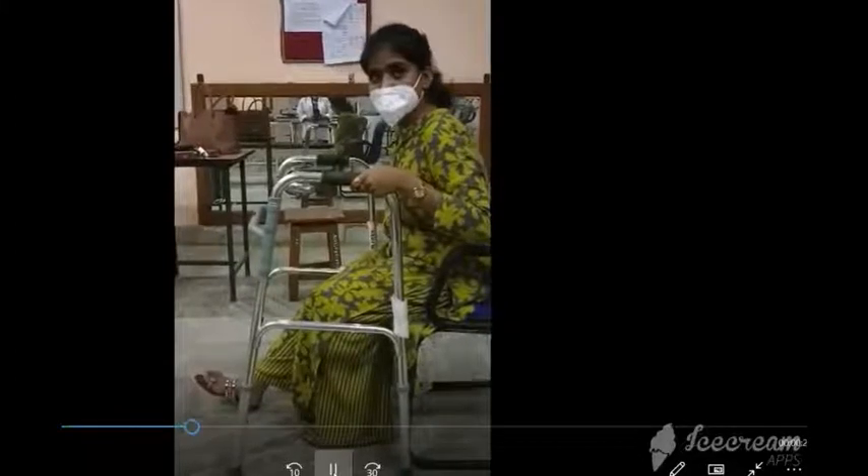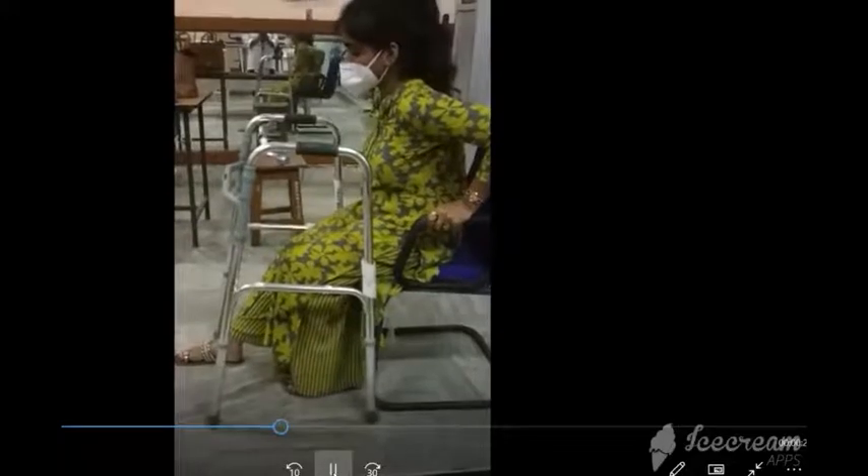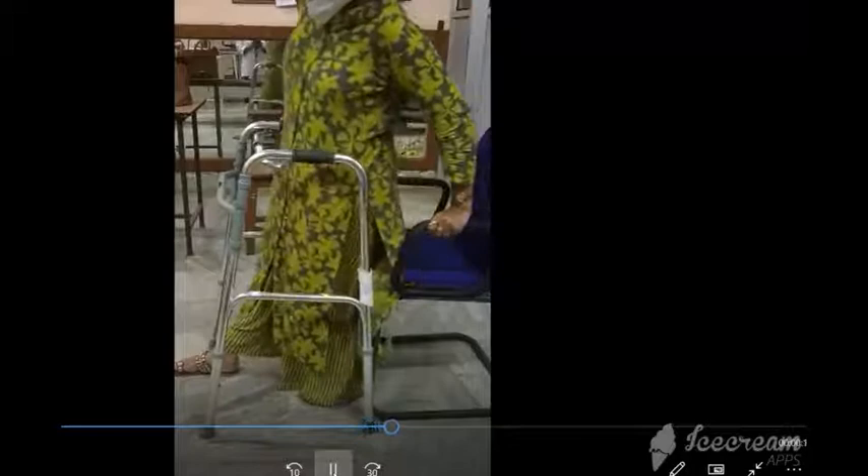Place one hand on the chair and the other hand holding the walker, then push up to stand.